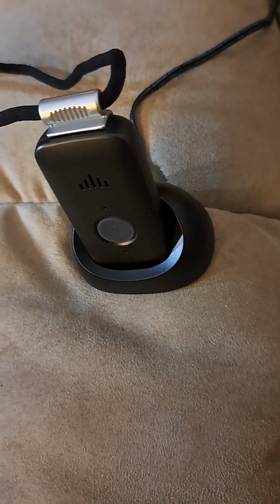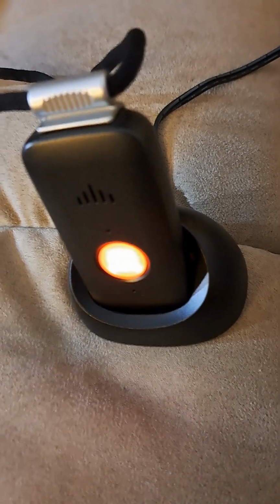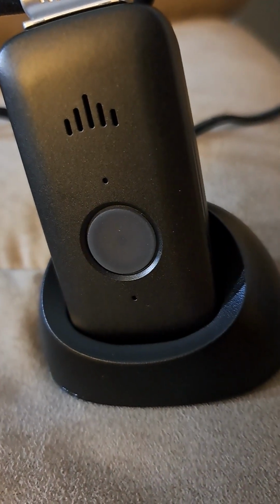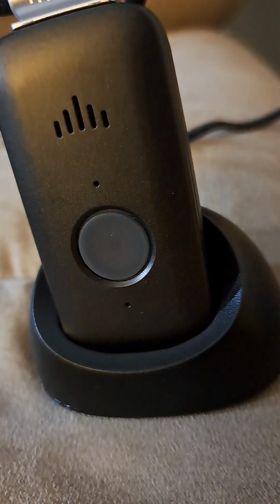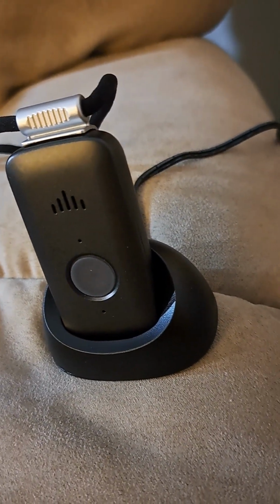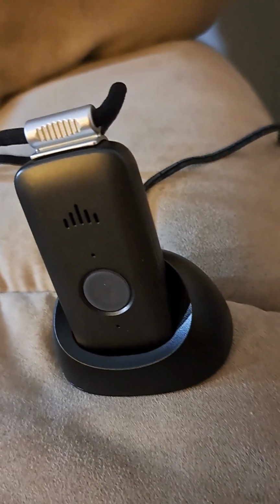You'll leave it sit there for about 5 or 10 seconds. And you see the light will start flashing orange, but there will be an audible message that comes across the Lifeline that says charging. Charging. Right there. So now it will flash orange, but it will also flash a blue light to let you know that the device is getting signal.